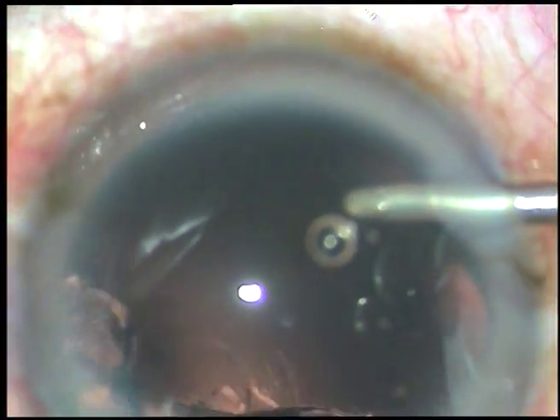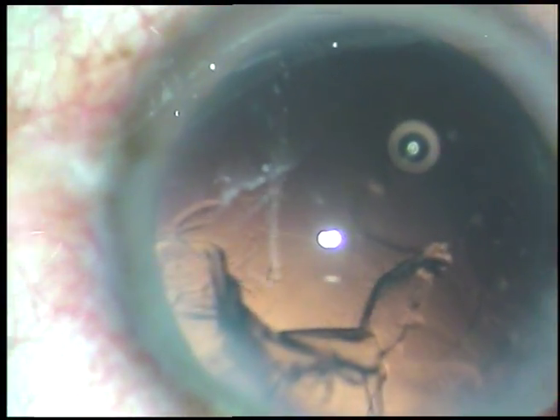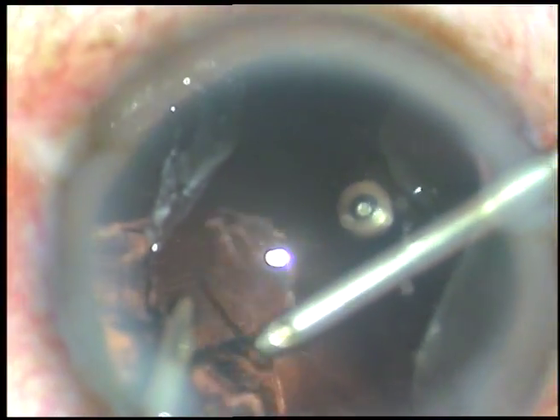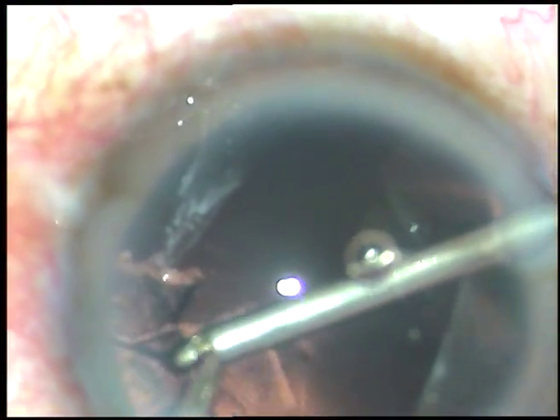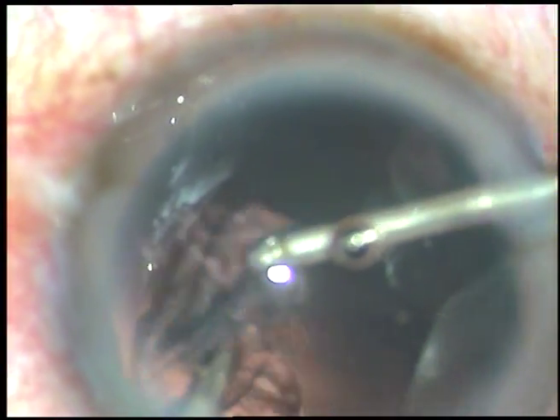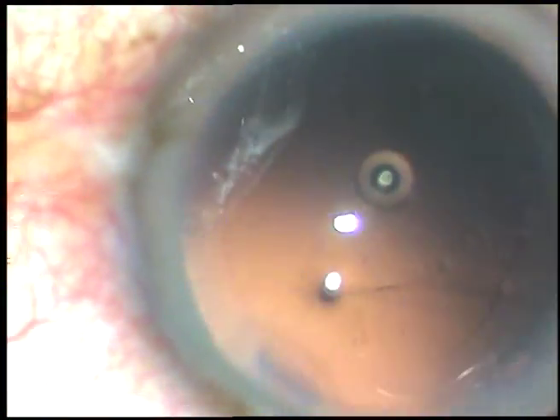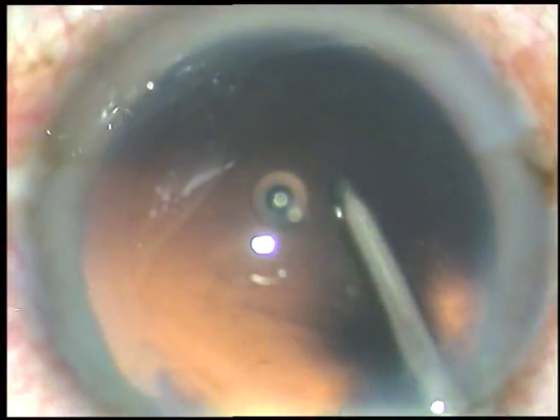Irrigation is through the right side port and aspiration through the left. Now I change hands — irrigation is through the left side port and aspiration through the right. Bimanual irrigation aspiration is a very nice and simple technique. The anterior chamber remains formed and you can approach any place, and the side ports can be really small.